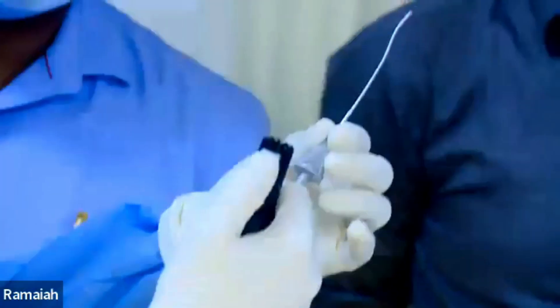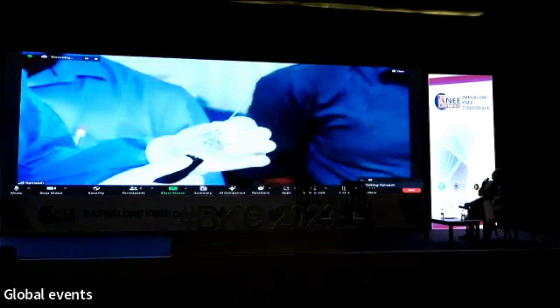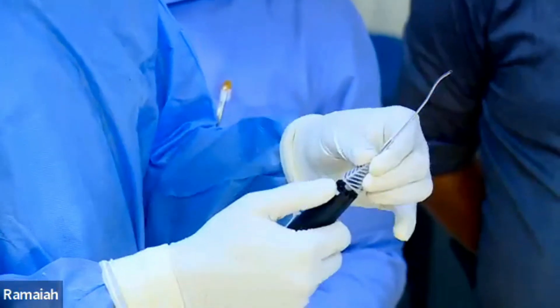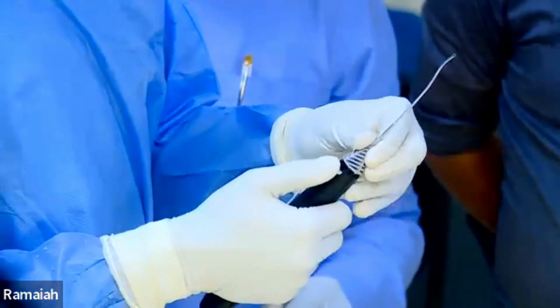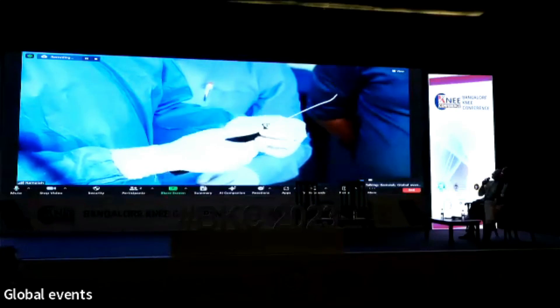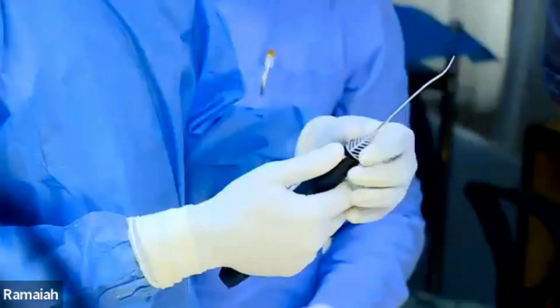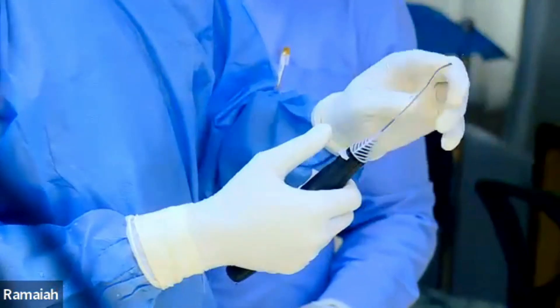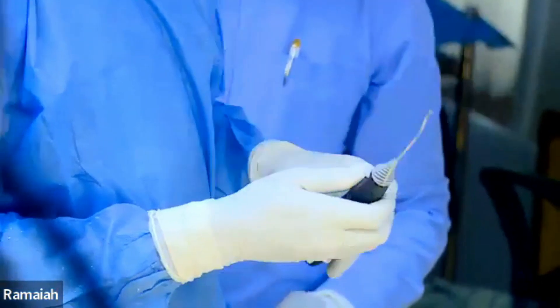There is a special little knob here. With this knob, we can actually fix the needle in any angle that we want — it allows 360-degree access. So whichever way you want, you can fix it. This is for the posterior horn and middle area of the meniscus.